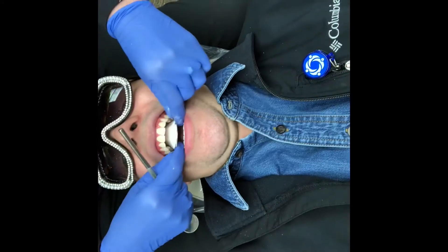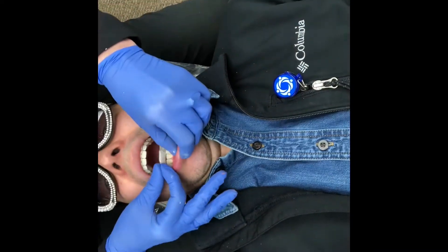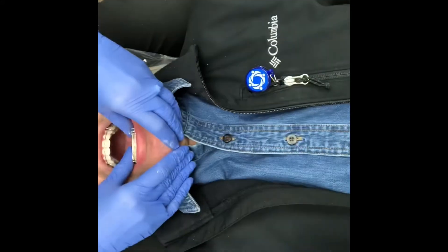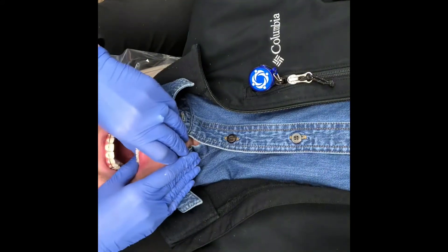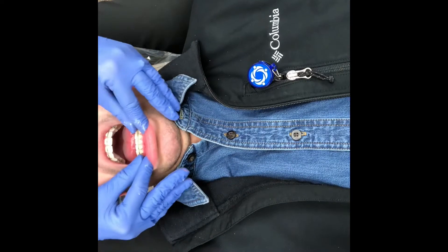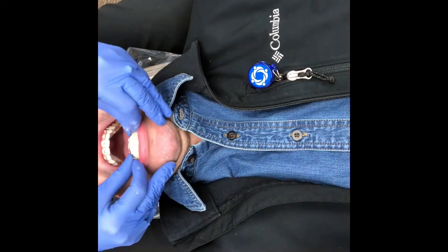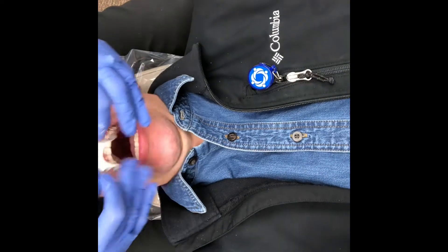You see how I'm taking it in? Same thing here. Nice and snug. Nice and snug. Does that hurt you when I take it out? Mm-hmm.